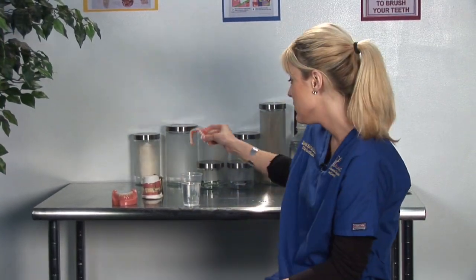Once you've finished brushing the dentures, you always want to put them in a dipping bath and let them sit overnight.